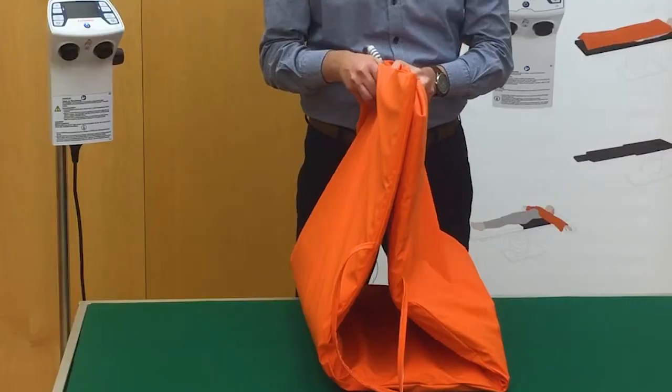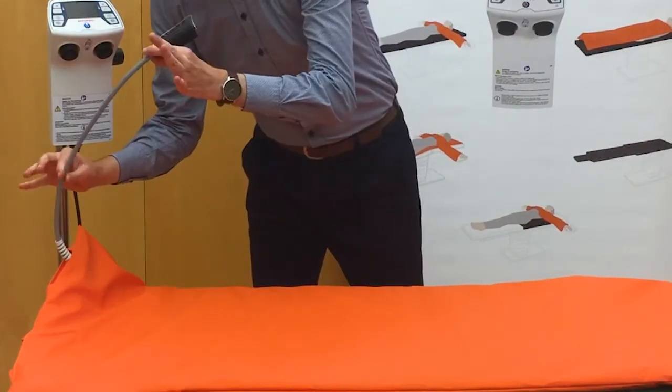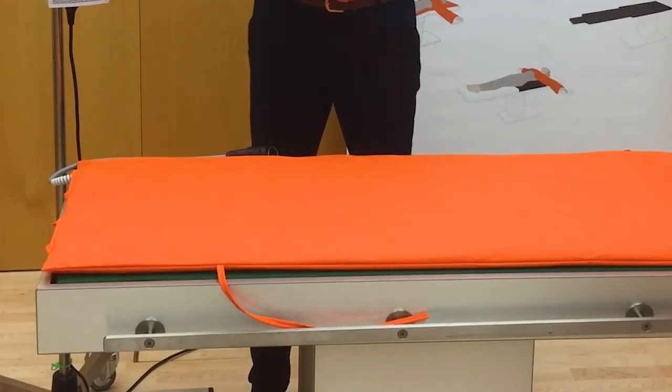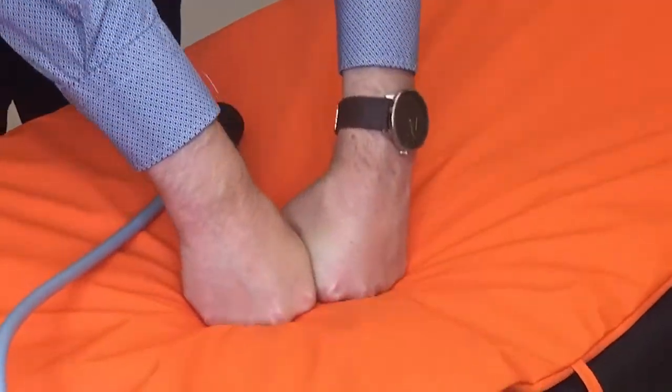For using the Astopad blanket under the patient, place the blanket lengthwise on the OR table with the cable connection side pointing to the outside edge of the table. The Astopad blanket must be positioned flush with the head or foot end of the OR table. If the OR table has a viscoelastic foam and a warming blanket is placed on top, the pressure-relieving benefits of the foam are still applied to the patient.